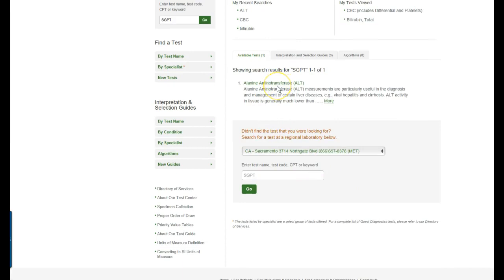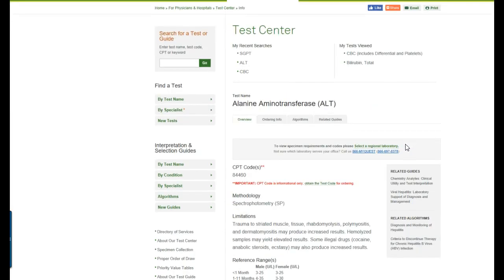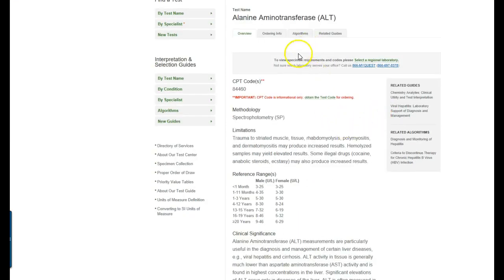And there we go. So SGPT comes up as alanine aminotransferase otherwise known as ALT and so here's how you're going to find out what tube color this test will be drawn into. So the very first time you log in you may have to select regional laboratory and it may prompt you to do so. If so you want to select the one that's closest to you.